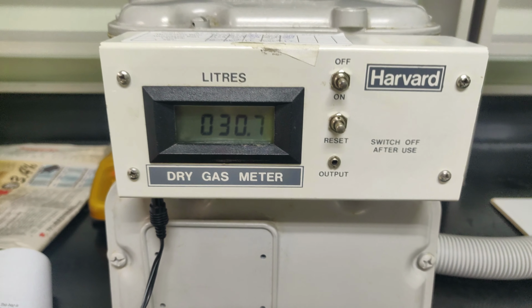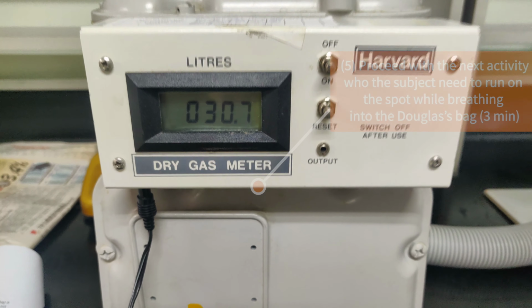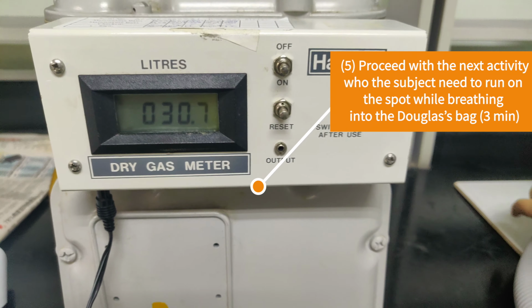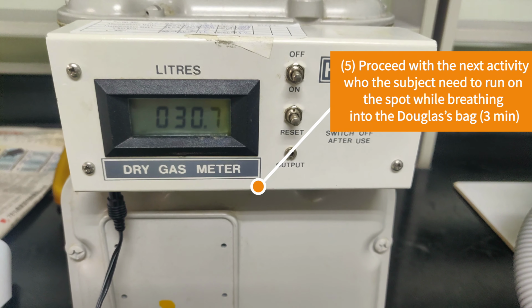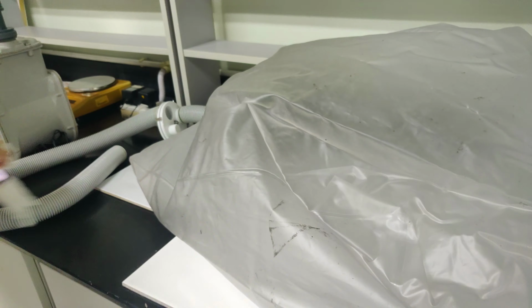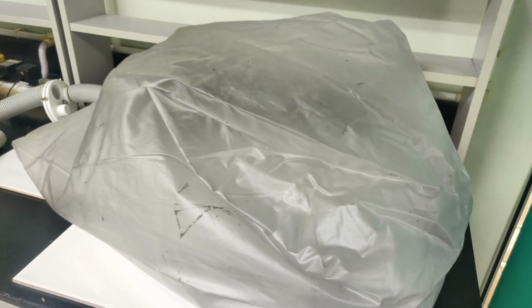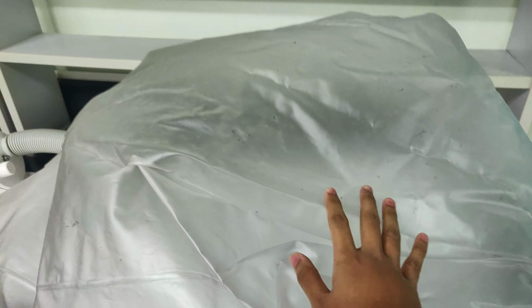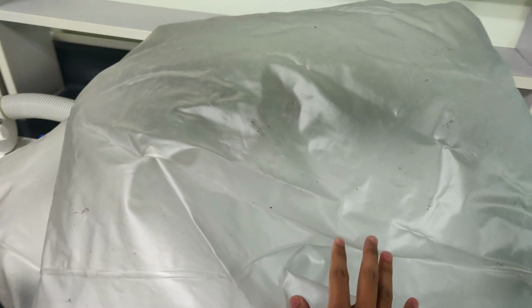We're going to proceed with the same things, but this time we ask the subject to run on the spot while breathing into the Douglas bag. This is the condition of the bag after the second activity. As we can see, the volume of air collected for the second activity is higher than the first one. After we finish, we need to connect the tube directly to the gas meter.